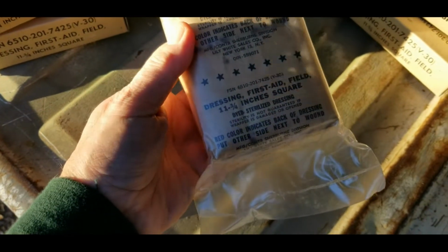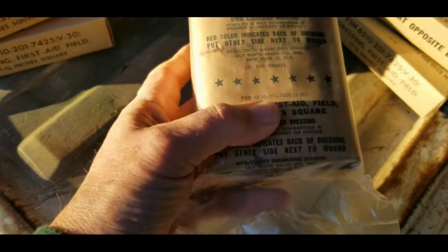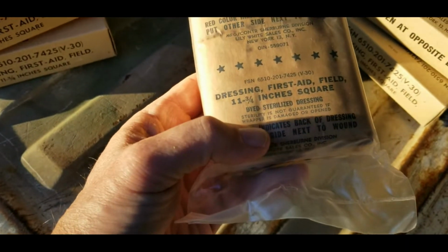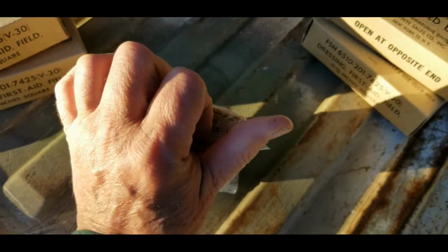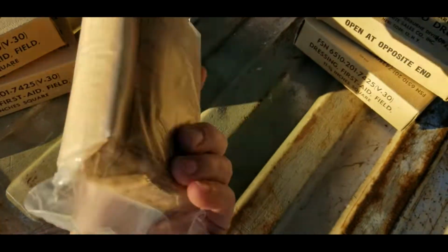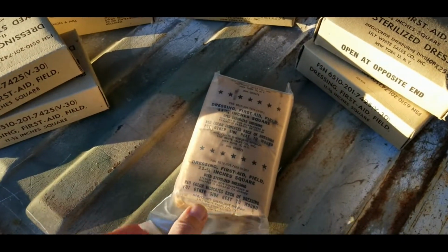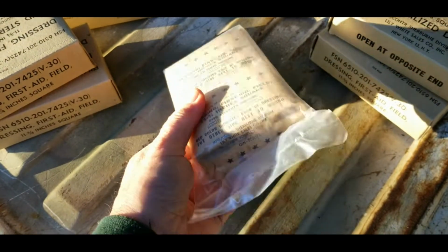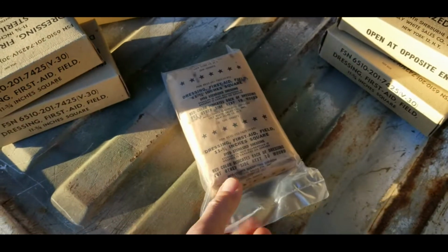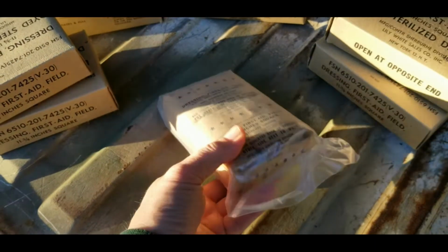So right away, notice after you take it out of the box that it says sterilized dressing. Sterility is not guaranteed if wrapper is damaged or opened. And these wrappers, even though I can't tell you how old these are, and they seem old, there's nothing wrong with this wrapper. I've seen nothing wrong with any of this stuff. So I would say that these are fairly sterile. But that's not my medical opinion. That's just the opinion of an idiot. But like I said, it seems fine.